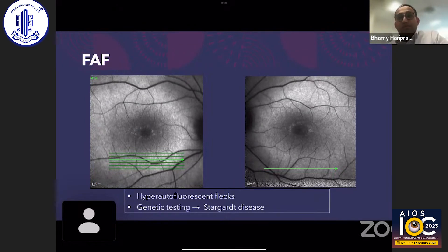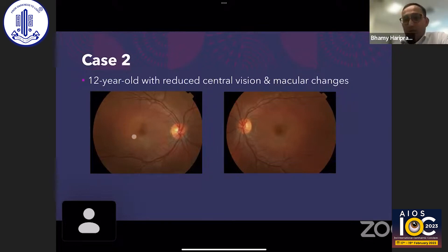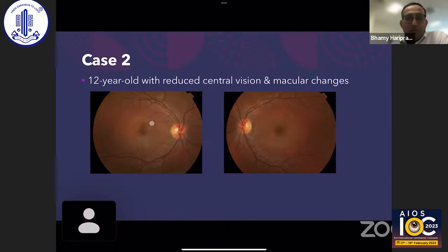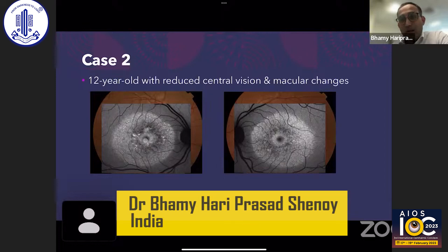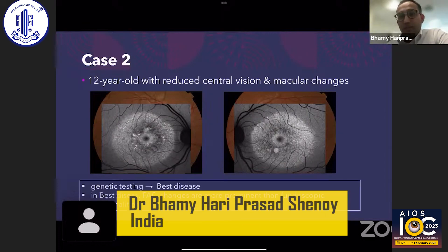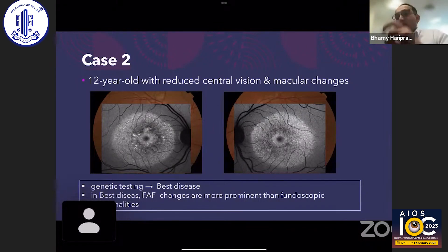Case 2 is a 12-year-old female referred with reduced central vision and macular changes. Fundus imaging shows macular and pigmentary changes. Fundus autofluorescence reveals the enormity of the lesion — not fully appreciated on fundus imaging — with classical hyperautofluorescent dots and hypo-fluorescence inside, classic of Best disease. Genetic testing confirmed this. The key point: in Best disease, fundus autofluorescence is always more prominent than fundoscopic examination, so autofluorescence gives a better view of the lesion, even in early cases.